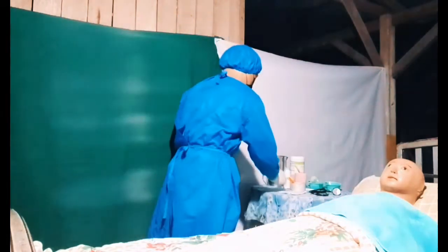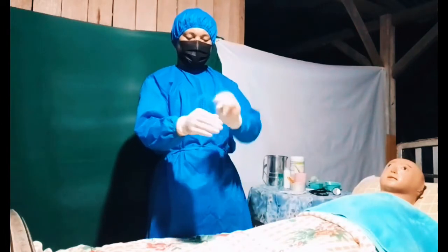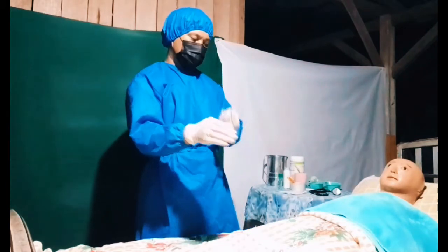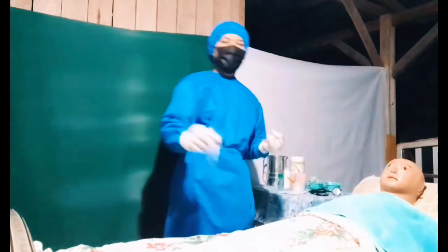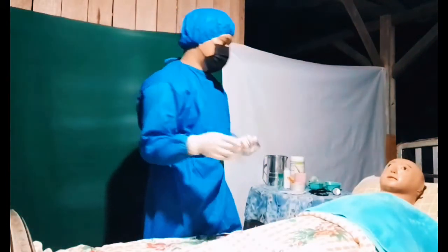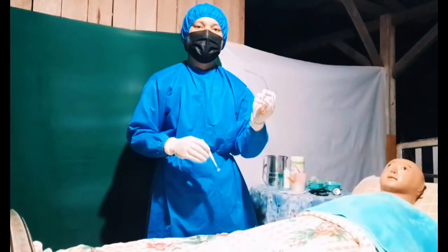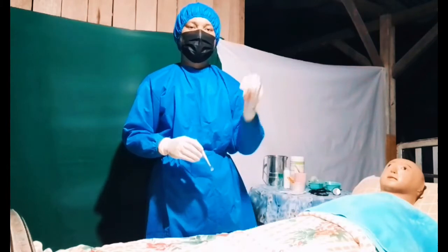Then lubricate the tube. Before insertion, using a flashlight, check the nose of your patient. Please close your eyes, ma'am, to see if there's a scar or anything that can harm your patient while inserting the tube.